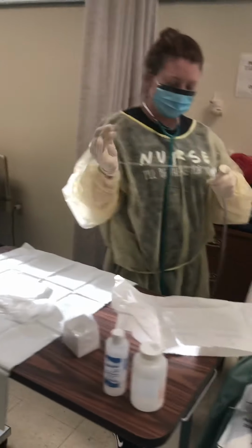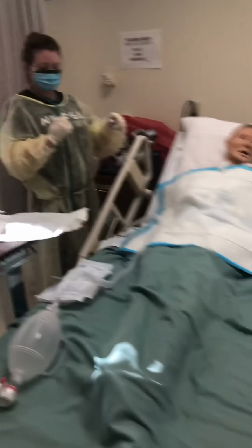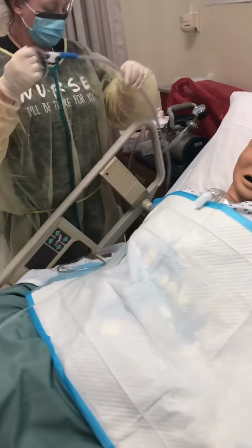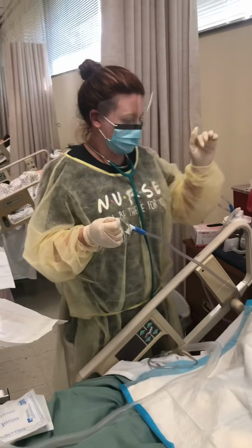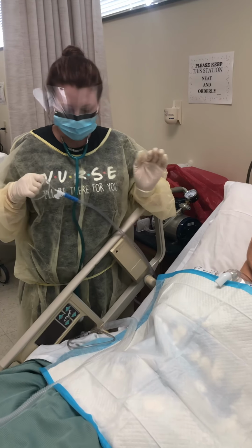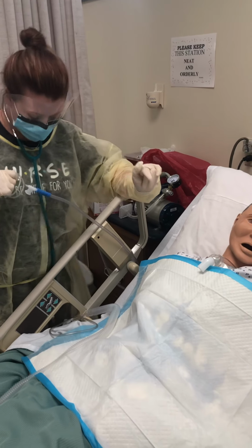So now I'm going to go over here to my patient and remind him that if he starts feeling uncomfortable or if he needs me to stop, to raise his hand up.